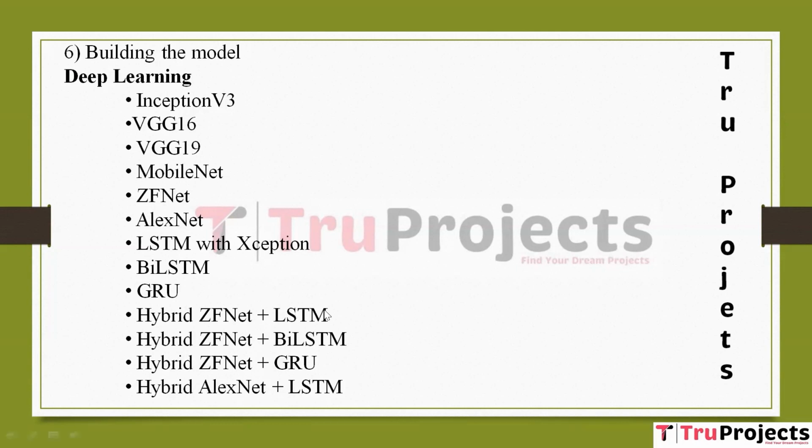And these are the hybrid models, which include hybrid ZFNet plus LSTM, hybrid ZFNet plus BiLSTM, hybrid ZFNet plus GRU, and hybrid AlexNet plus LSTM. The hybrid models mentioned in the project combine deep learning architectures with recurrent neural networks. These combinations aim to leverage both the strength of CNNs in image feature extraction and the sequential data processing capabilities of RNNs to improve sleep apnea detection.